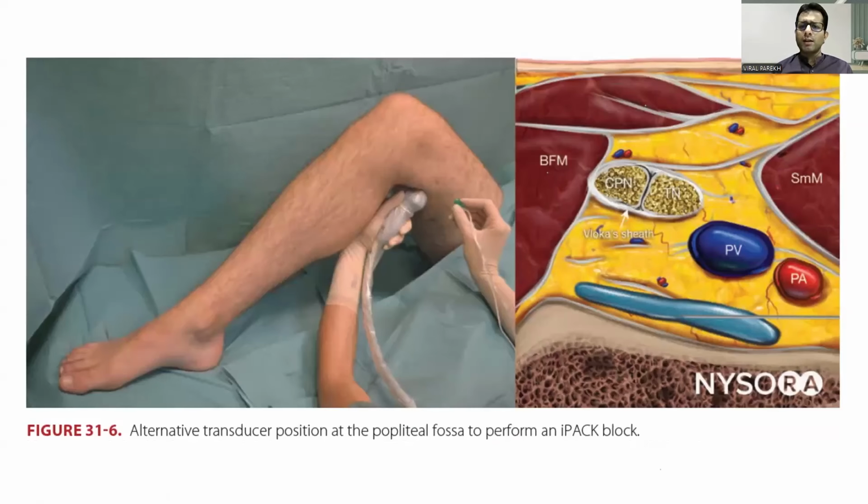This is the posterior approach. As we can see, it is similar to the popliteosciatic approach, but we move the probe more cranially till we see the posterior shaft of femur and we deposit the local anesthetic.